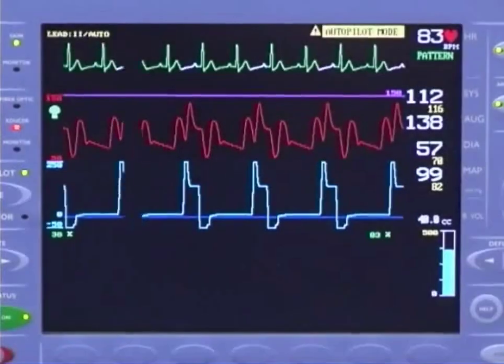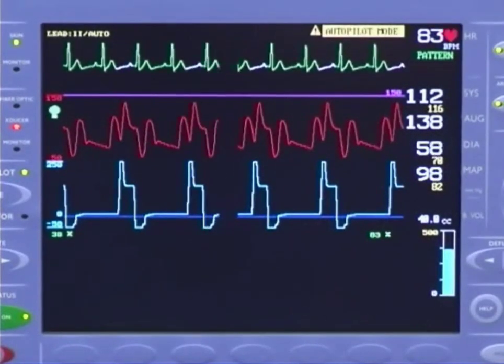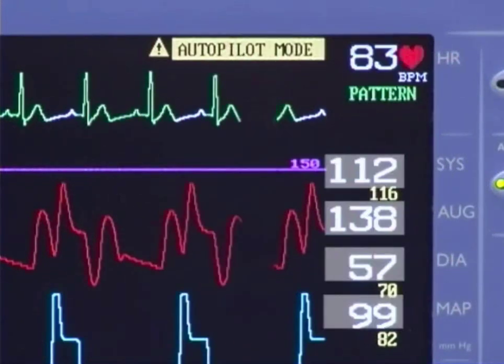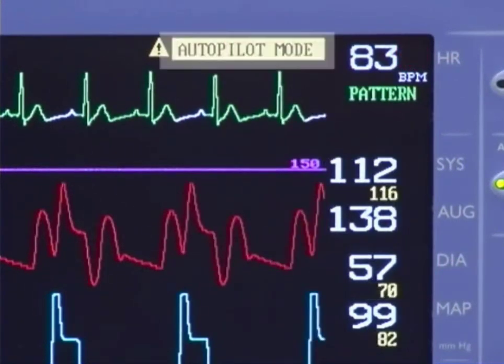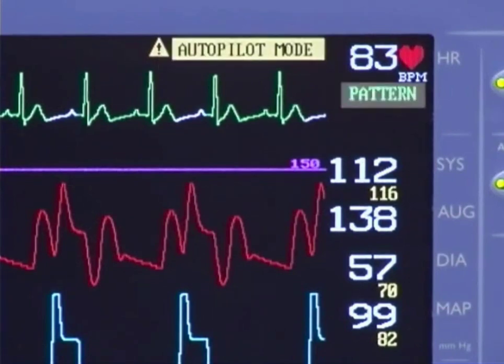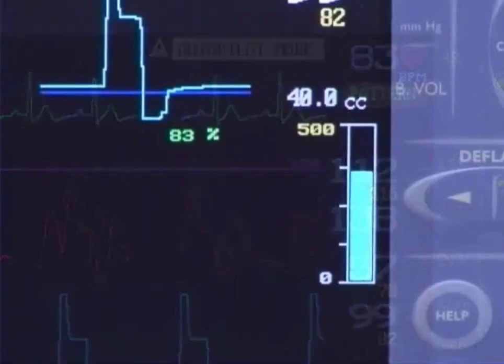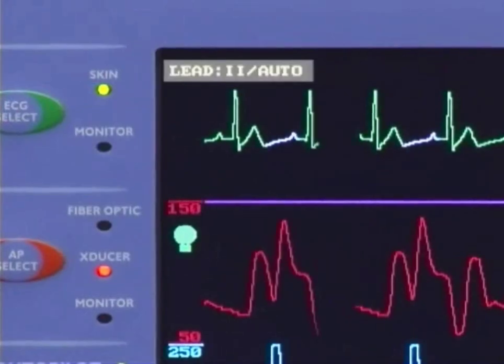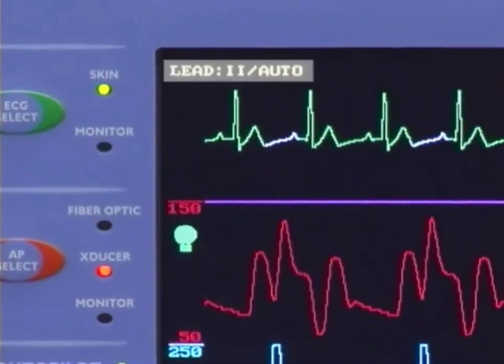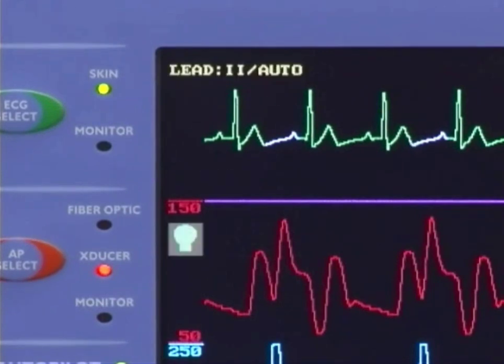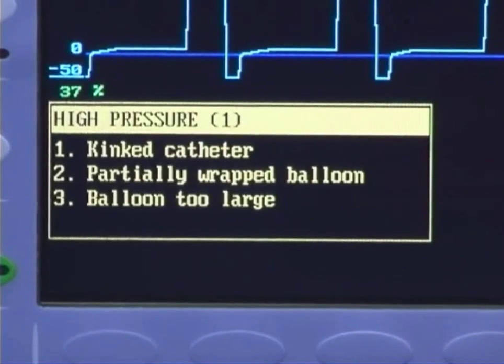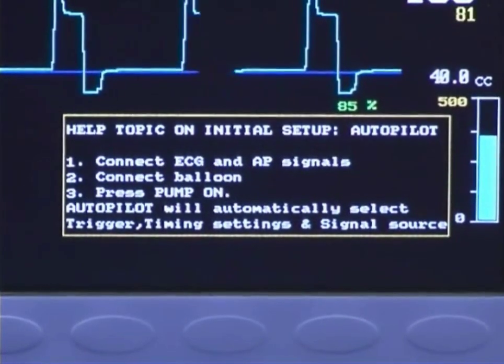The monitor also displays physiologic data: heart rate, assisted and unassisted blood pressure, operational mode, trigger selection, balloon volume, helium tank gauge, ECG source and lead, fiber optic status if the AutoCAP II Wave pump is used, alarm messages, and help messages.